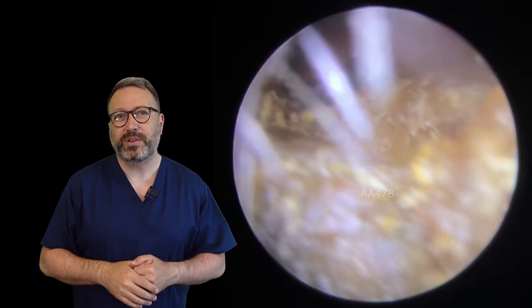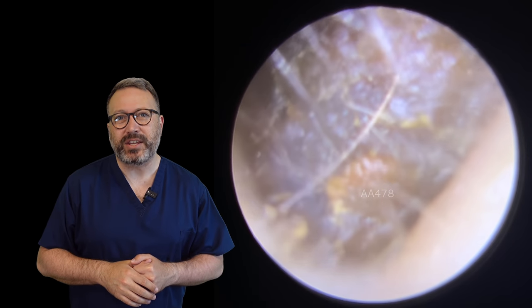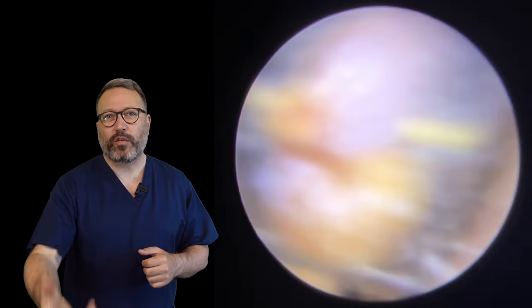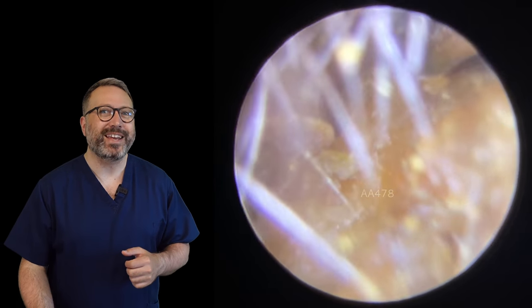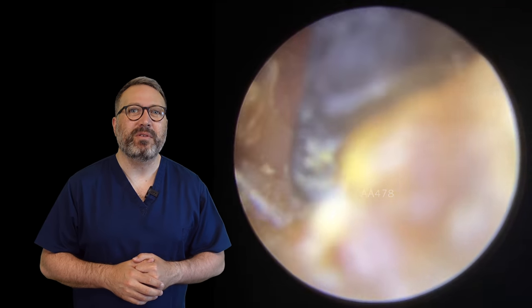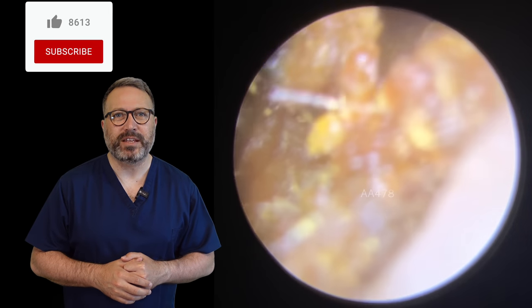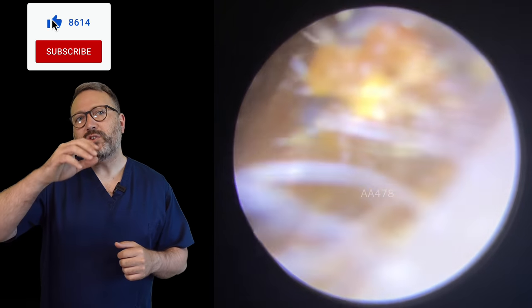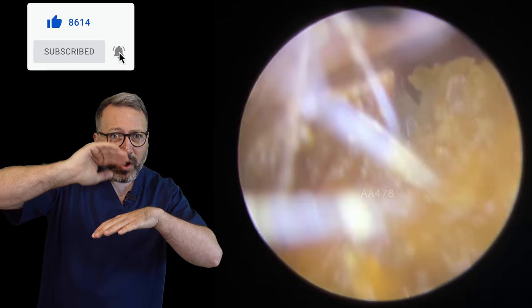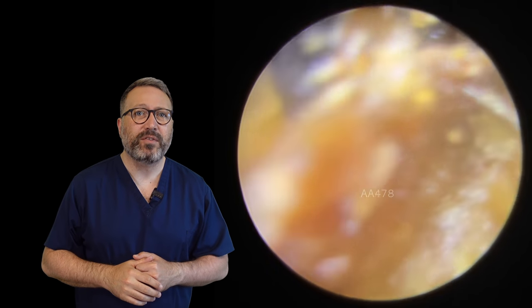You can see we've got the Jobson horn in here and this whole section of wax is just solid on the outside, but there's really soft material on the inside. The outer shell's hardened up, but you can see it is just everywhere in here and we just need to start chipping this away. When we try and get the Jobson horn over the back section of wax, it's just a bit too high up, so we're going to start clearing away from the canal walls.